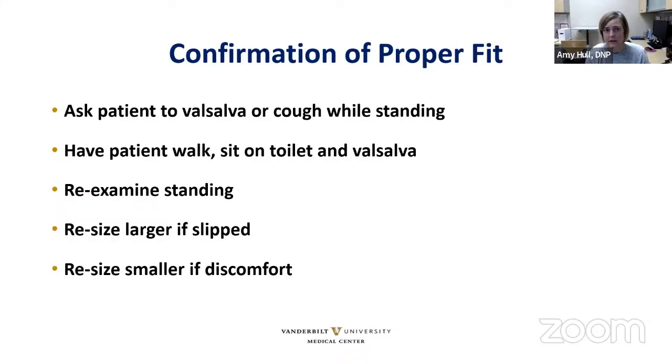I tell patients all the time, if you're pushing and pushing and then finally that pessary falls out, it may not be perfect, but it might work. If I can keep a pessary in 90% of the time, it is not perfect, but it may be satisfactory. If it never falls out, except maybe when they're trying to have a bowel movement, maybe they just need to take it out, have the bowel movement, put it back in, or have a hat at home, and there's their safety net.